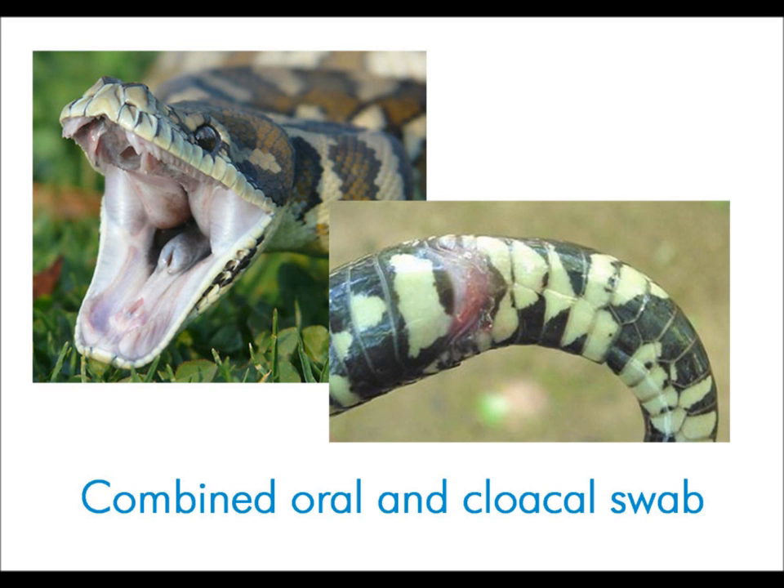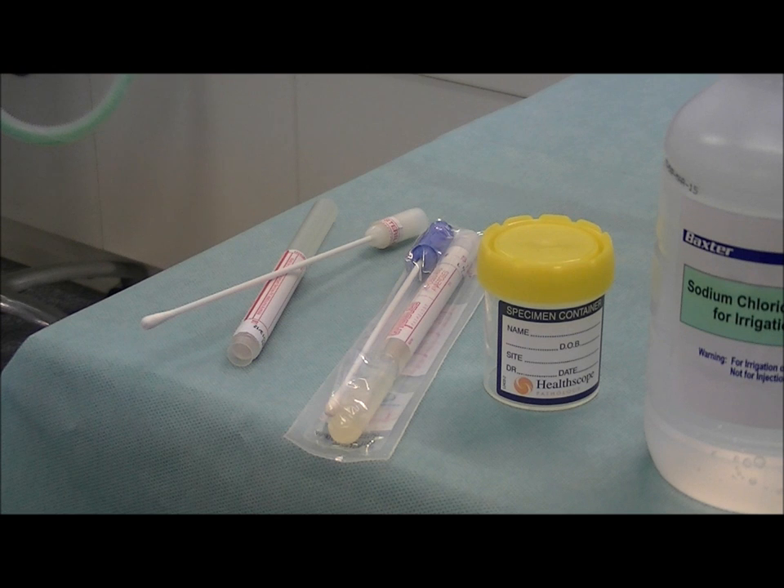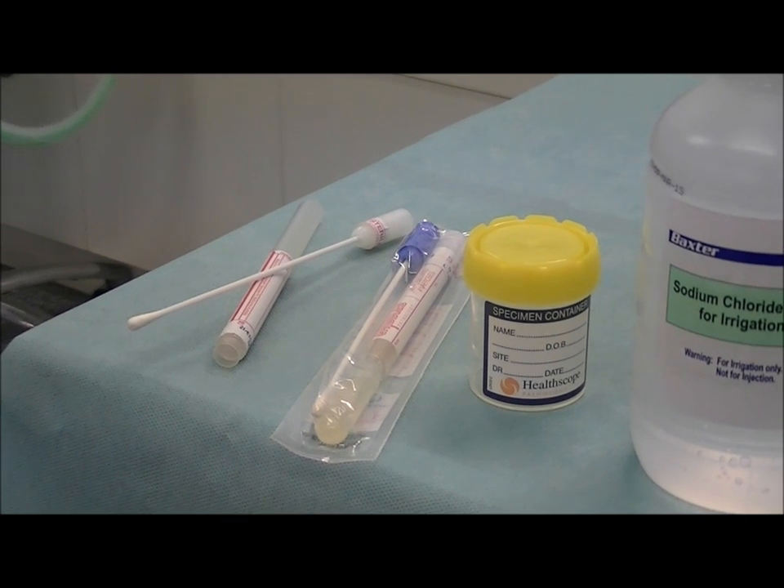We are going to run through the required equipment now. The first thing that you need is a sterile cotton swab, shown on the left. You should avoid using bacterial culture swabs — you can see the gel material at the end of that tube. That swab is designed to culture bacteria and we don't want to do that. We don't want to facilitate bacterial growth.